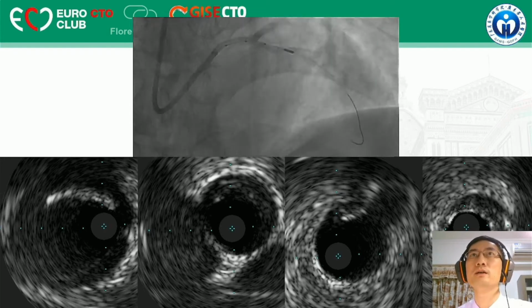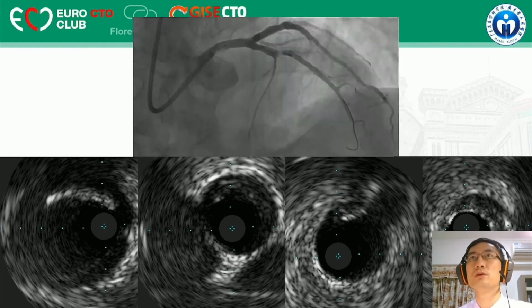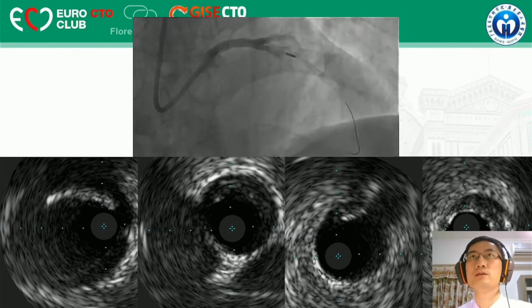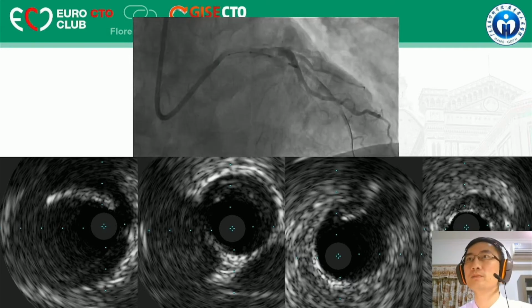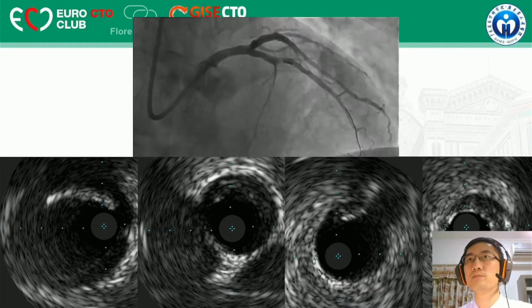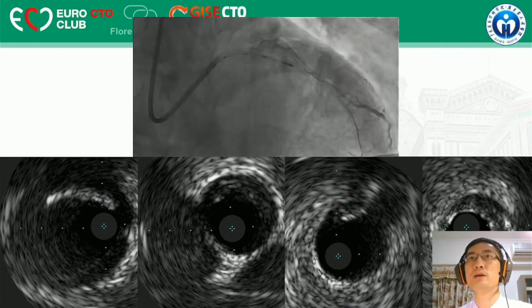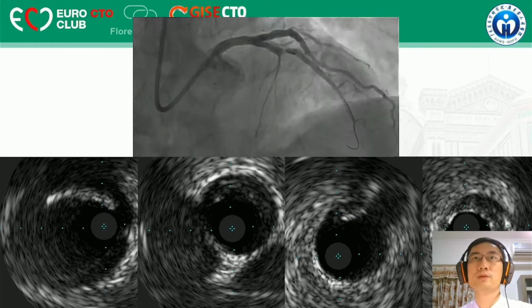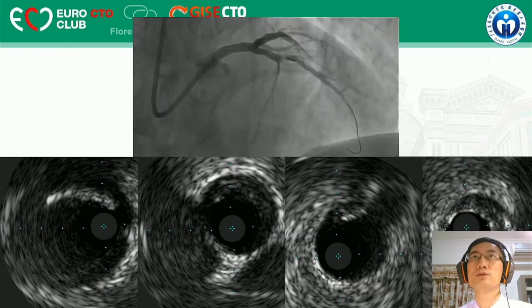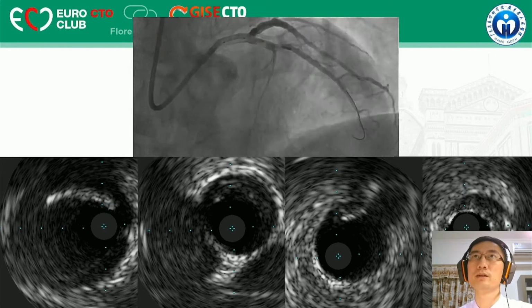In our center, only the Volcano IVUS is available. So first, we pull back from the diagonal. Can we see anything like an occluded LAD? Distally, there is some stent. Proximally, there is a small side branch this way. The side branch goes up. And proximally, a bigger side branch on the opposite side. That must be the so-called septal, but nothing looks like an occluded LAD.